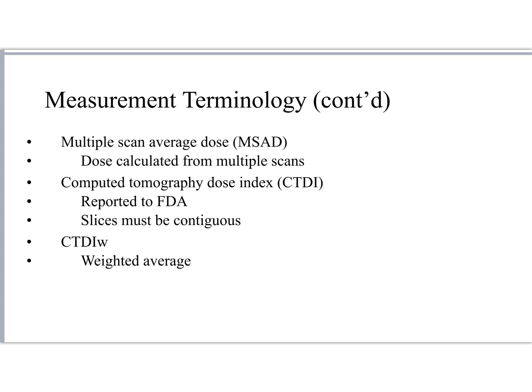All right, well, what are ways that we can actually measure this, given this overall complexity here, both with the changes in the volume of imaging, like with the patient thickness, and then also with this tailing effect that happens, this radiation penumbra. Well, we have to think about things as averages, and we very oftentimes work in averages. Anytime we're doing any kind of radiation dosimetry consideration, we're working in approximates.